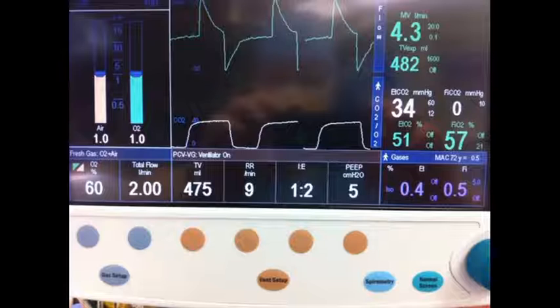This is critically important information because it's telling you two things. First, that your attempts to keep the airway open are effective, and the second thing is that your mask ventilations are adequate to eliminate carbon dioxide. If this trace disappears, your efforts at mask ventilation are failing.